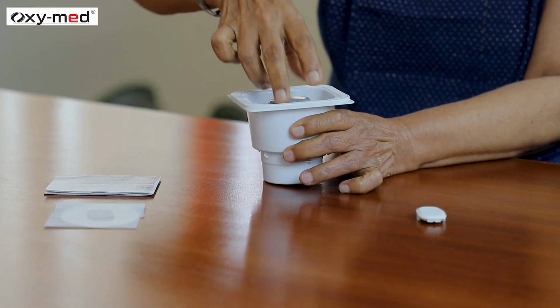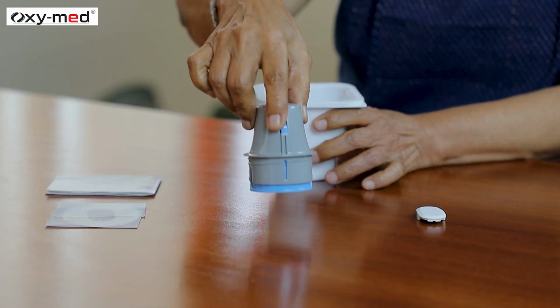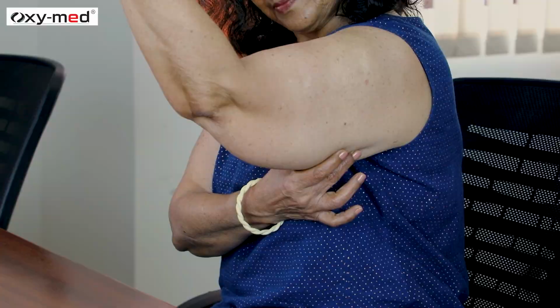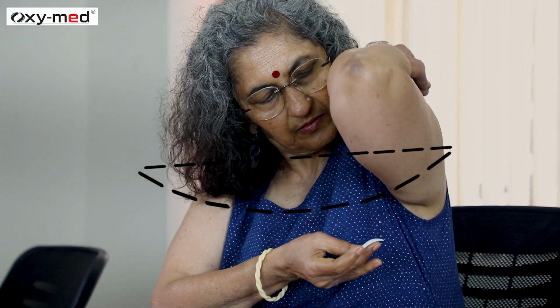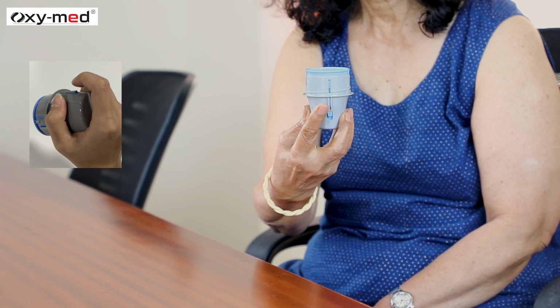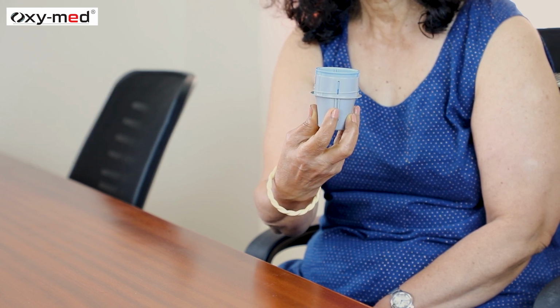Rotate the applicator counterclockwise and lift it out of the box. Choose an insertion site that has an adequate amount of fat, avoiding the muscle. Wipe the insertion site with an alcohol pad and let it dry. The forefinger should be in the position of the side button so that it is more convenient for the user to push when inserting the sensor.